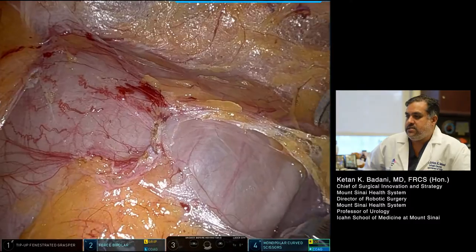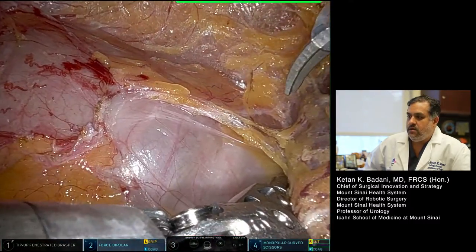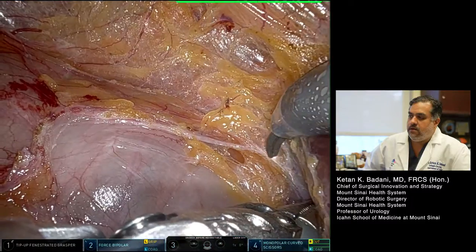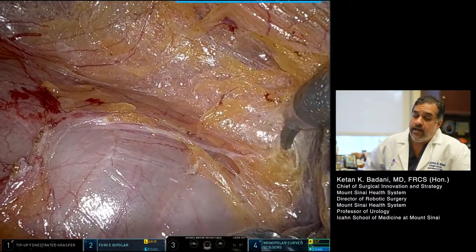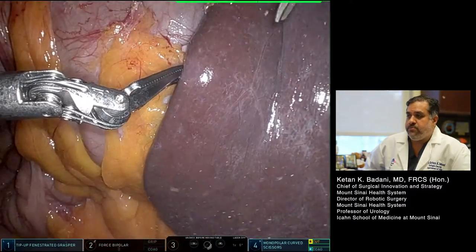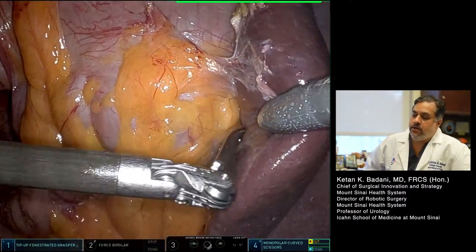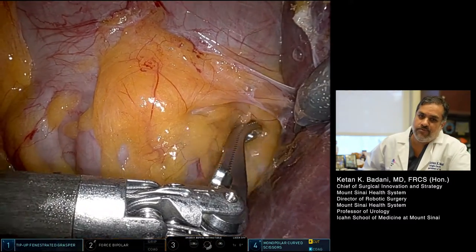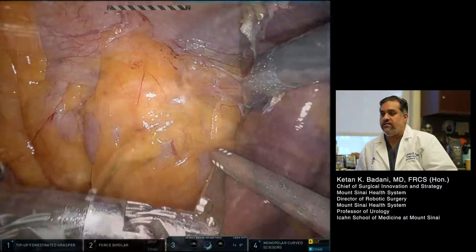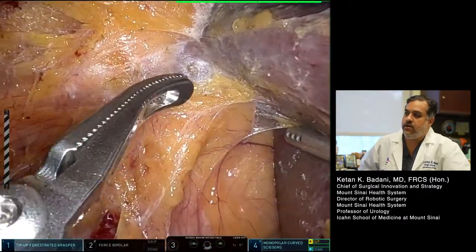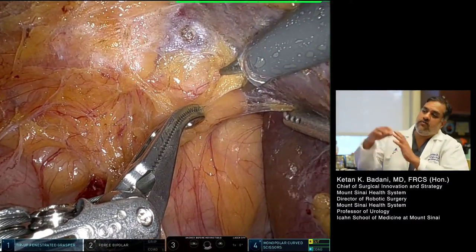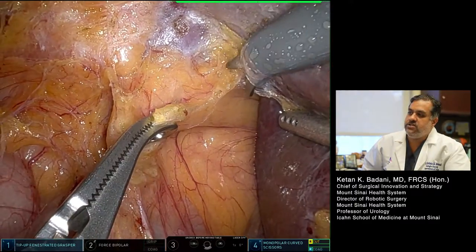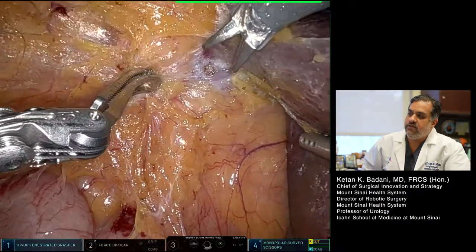Here we see a nice release of space between the kidney and the liver. I use a locking retractor on the right side when I want to reflect the liver. I don't always put a liver retractor port in — typically I'll look and see how much of the liver is covering the kidney, and if I do need to retract the liver, I put a 5mm sub-xiphoid port to do a locking, grasping, static liver retraction. Now we're seeing where the kidney and the liver have adhered to each other.